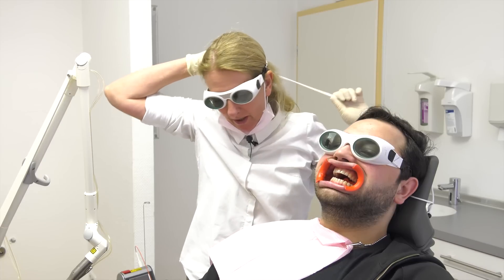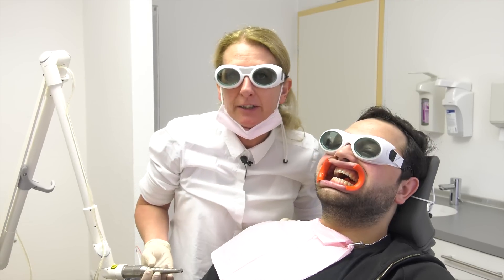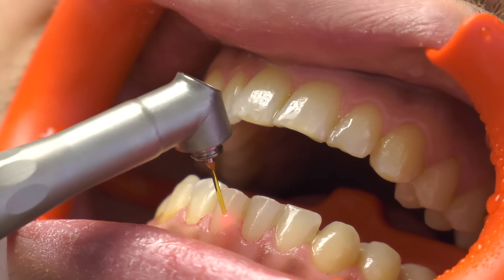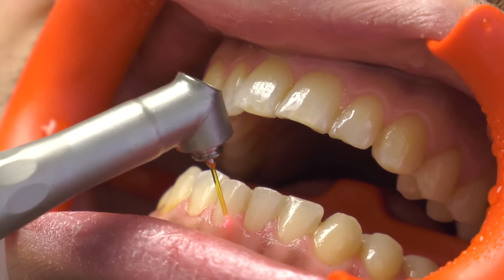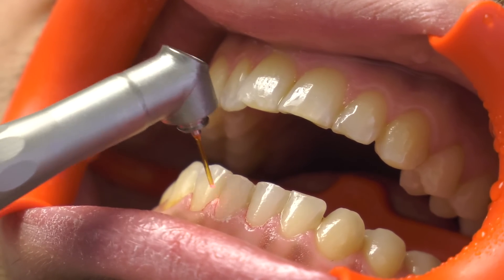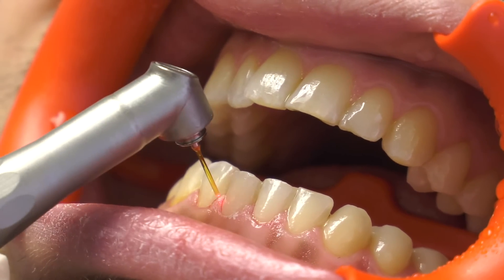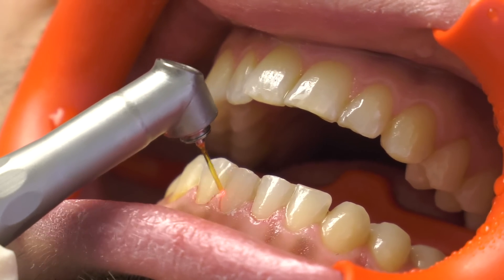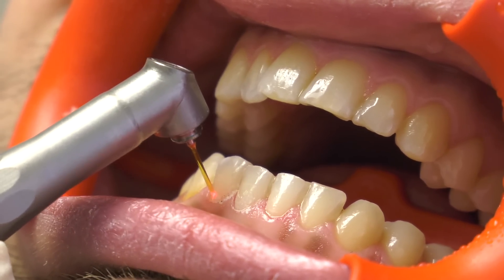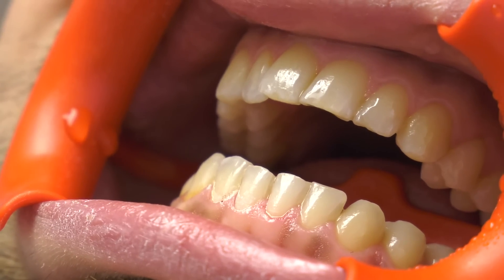We do have to wear our laser safety glasses - just come a bit nearer and have a look. The advantage of taking off the tartar with the Erbium YAG laser is that it does not hurt. It is nearly painless at the hypersensitive tooth. Every medical equipment has disadvantages - also the Erbium YAG - because you can see it works a bit slower compared to the ultrasonic.